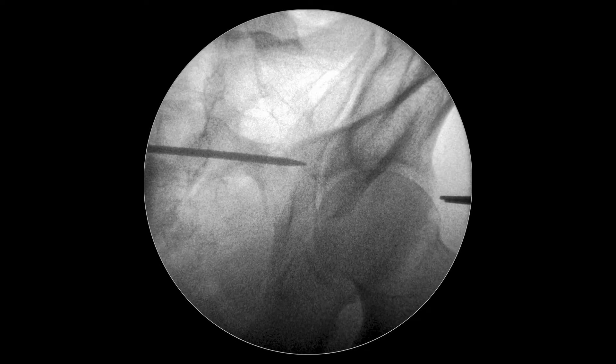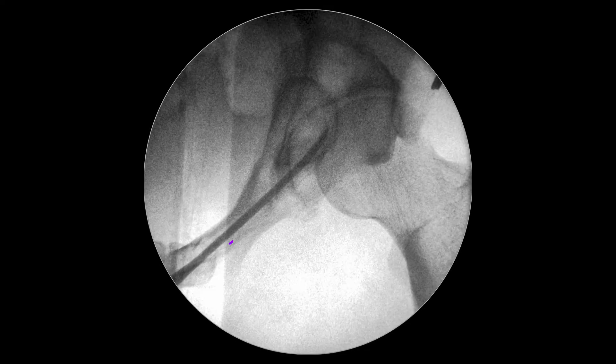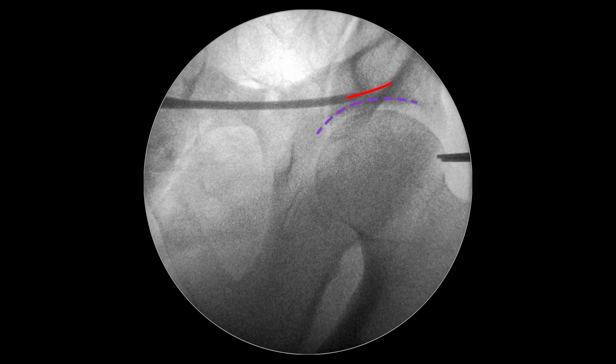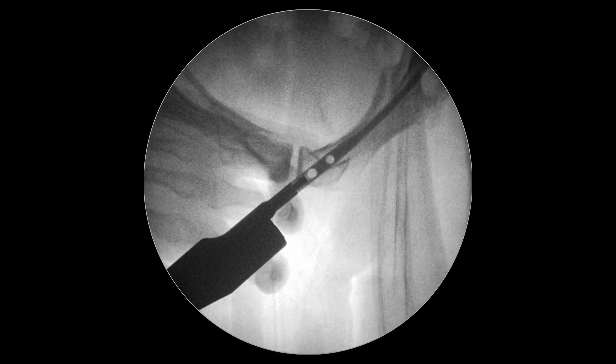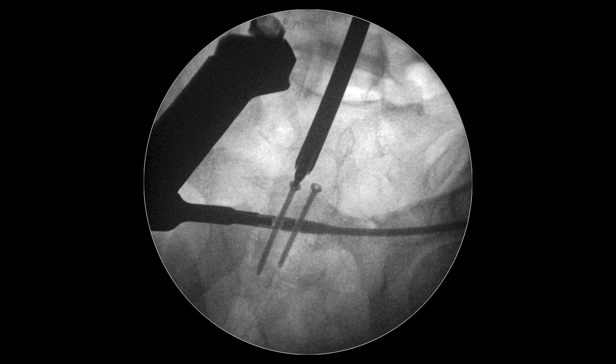The handle is now pointing up and towards the patient's belly. While passing over the joint, turn the tip upwards away from the acetabulum. The handle is directed perpendicular to the patient's body. The pin is springing off the subchondral bone. When the nail is sufficiently sunk into the pubic bone, lock it with the two screws.